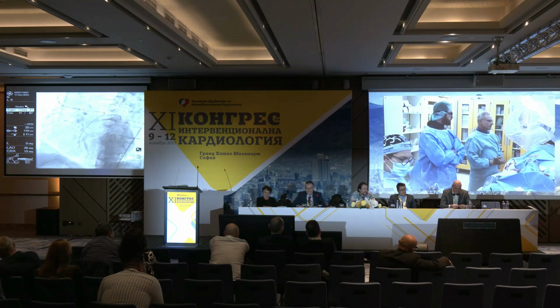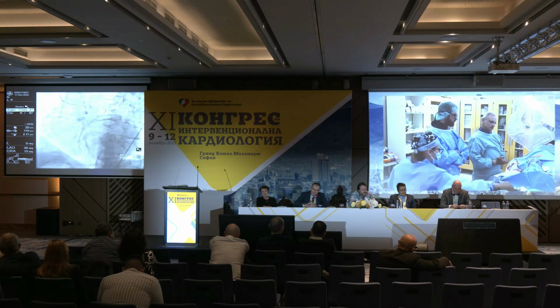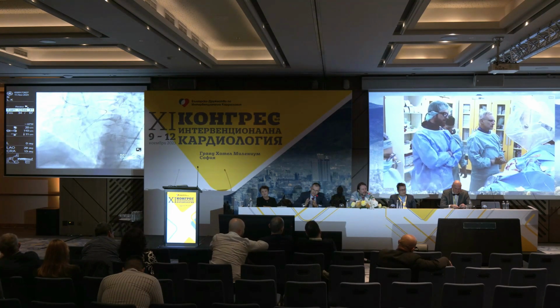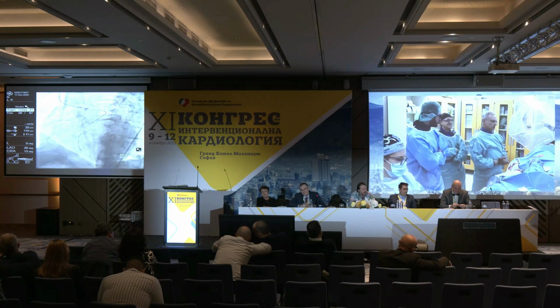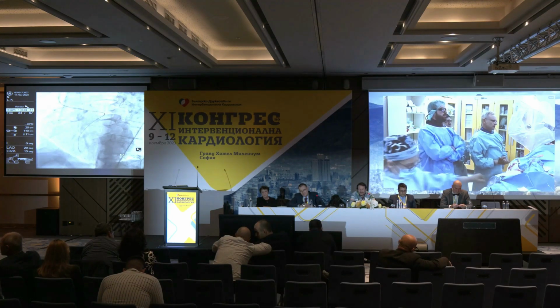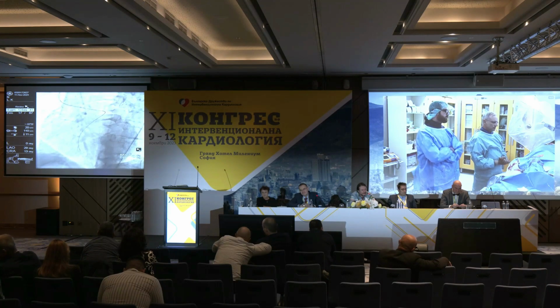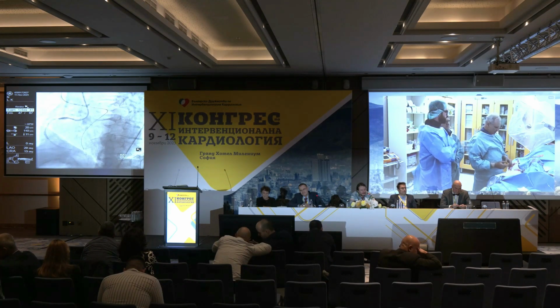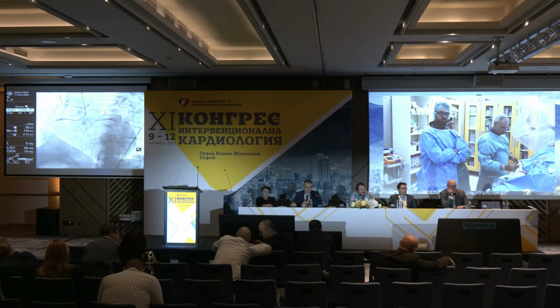We are preparing the IVUS. It is essential for what reason? The vessel is very big. It will show us whether we were really true to true. Yeah, he wants to confirm that. The fact that the wire went all the way up, we know that in 25% of the cases with IVUS studies, you think that you're true to true, but you are not.